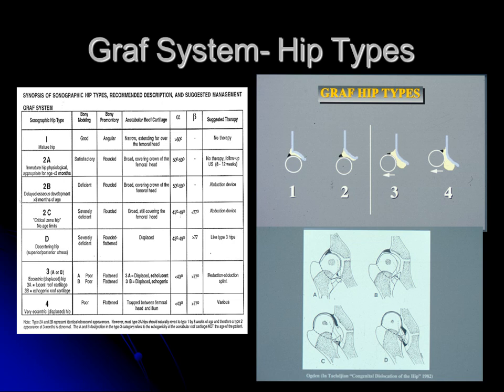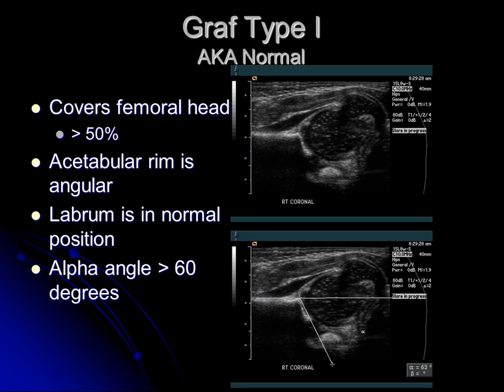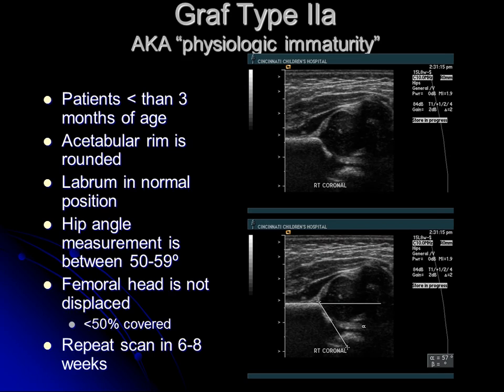There is a grading system from normal to abnormal — it's the Graf system. It goes from type 1, a normal hip, to type 4, a frankly dislocated hip, with a variety of findings in between. Graf type 1 is a normal hip. On coronal images you draw your line down the iliac, and the acetabulum should cover the femoral head at least 50% or greater. The morphology of the acetabular rim is nice and angular, the labrum is in normal position, the alpha angle is 60 degrees or greater, and transverse imaging shows no dynamic instability. That is by far the most common finding I see.